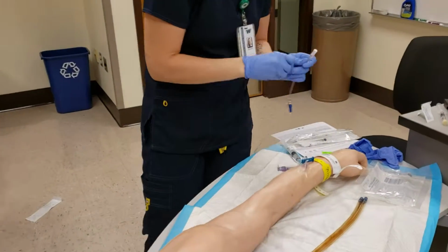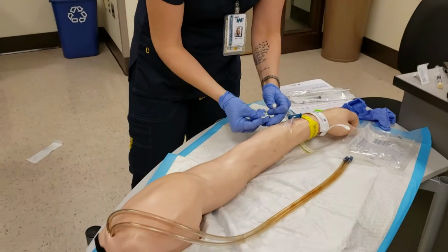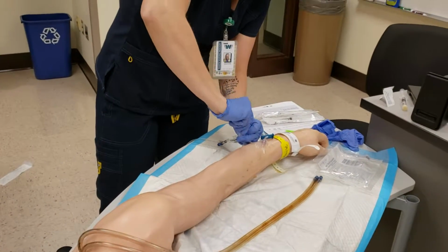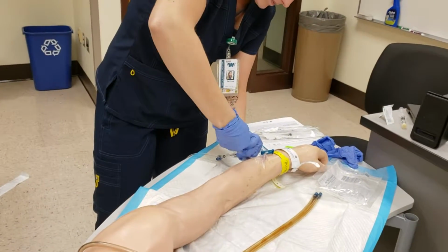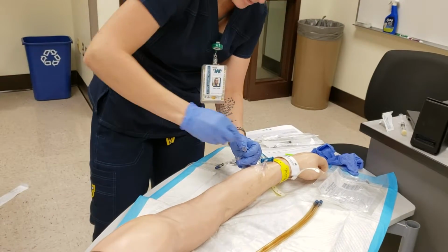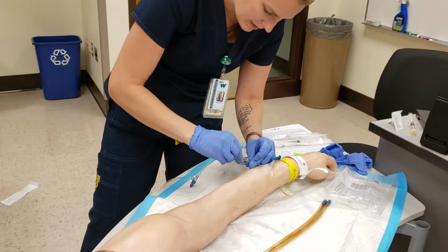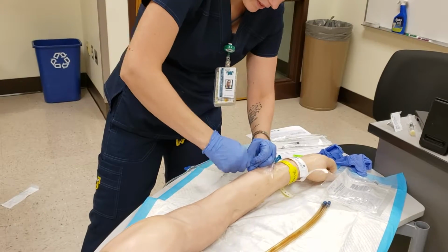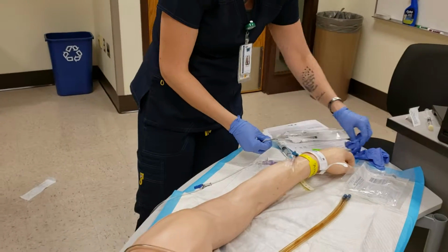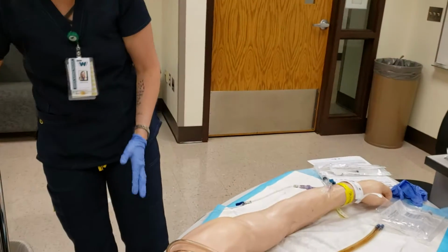So, got this ready. Go ahead and clean my site. Connect these. All right, Shirley, how you doing? Perfect. All right, so then I'll come back and check on you in a little bit, okay?